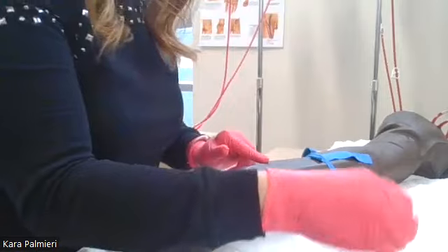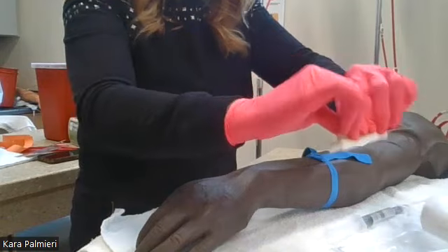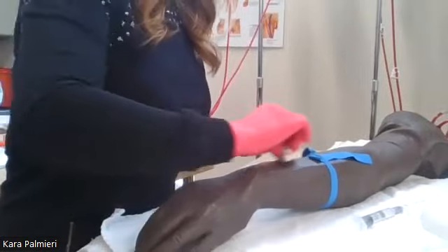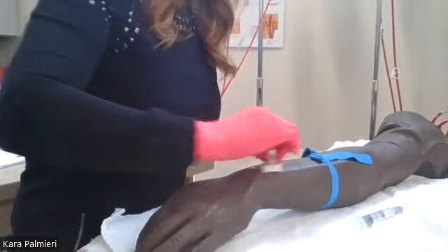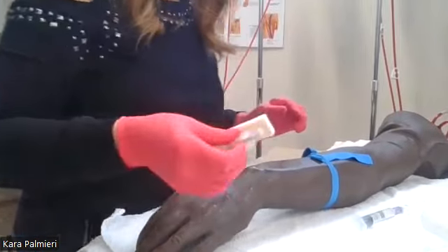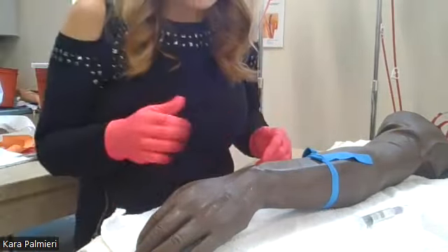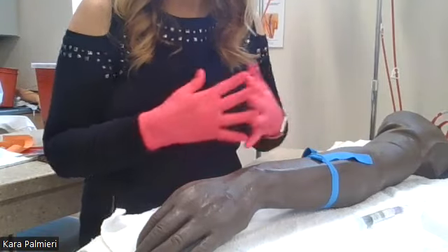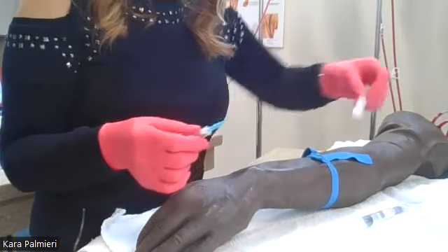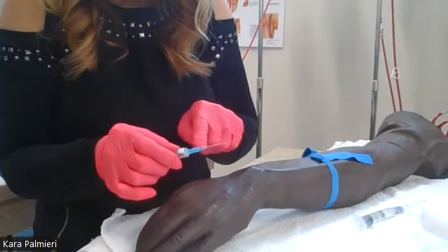So now I'm going to break my chlorhexidine. It's kind of like the other thing where you just squeeze it and it will saturate your little pad, and clean it like you really mean it, because you're going to poke through this. And we never want to introduce anything from the outside of the patient into the inside, into their bloodstream. All right, so I'm done with that. And normally I would let this dry, and it dries quickly on a real patient with body heat. Take off your cath. Okay. You'll see that this has the plastic part, and there's a needle down in the plastic part.